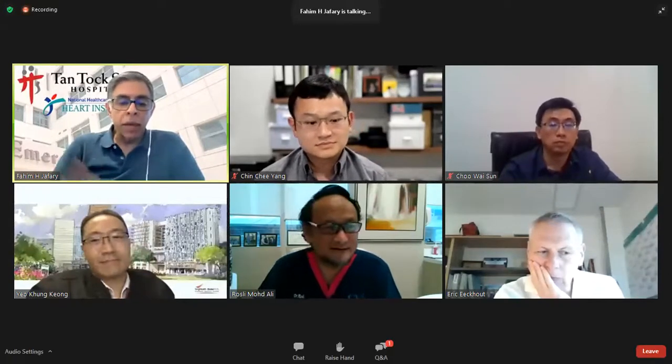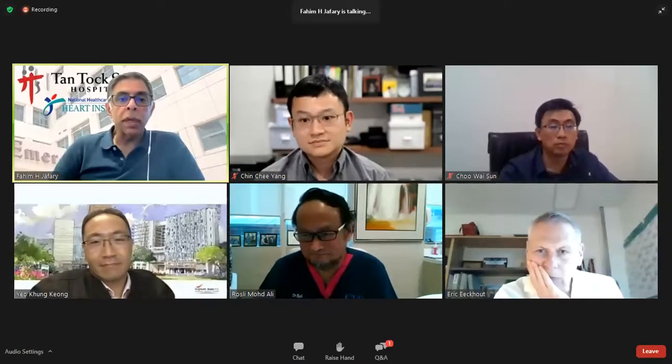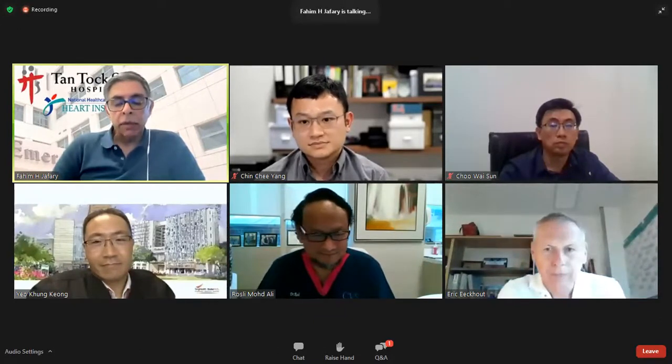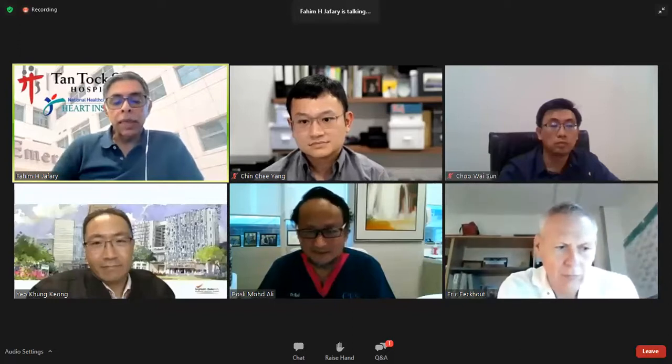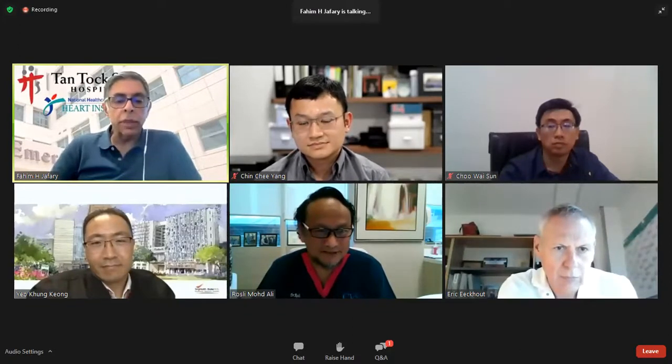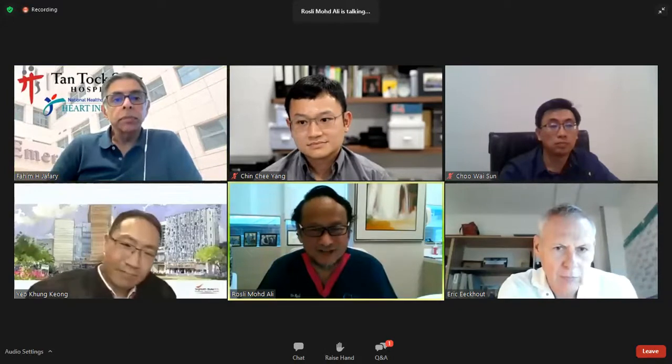What would you choose? I think that honestly, for me, all the modern drug-eluting stents are pretty much the same. I'll go by sizing. I'll go by what can grow appropriately for the vessel size. I think that's the key factor for me. The rest, I think they all have some fine points, but they're all pretty much the same. All right, Chiang.